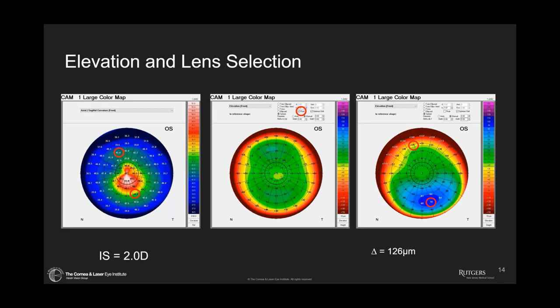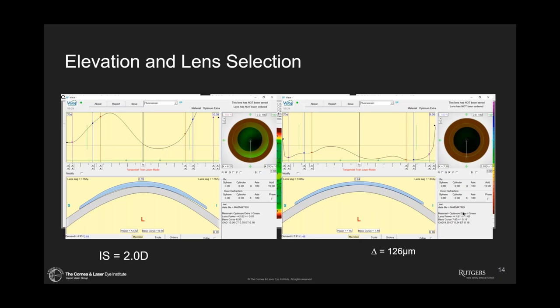Here's another one. This individual has very little corneal irregularity — their IS ratio is only two diopters, and when you look at the float they almost have no real central island. When we turn off the float, there is some vertical asymmetry but not a lot. Still, if we go with a radially symmetric lens we still have some inferior edge lift. But when we go to a geometrically symmetric lens you can see how it aligns to the cornea very well — just a toric lens is going to work perfectly adequate for this eye. Generally what I'm going to do is develop these lenses empirically.